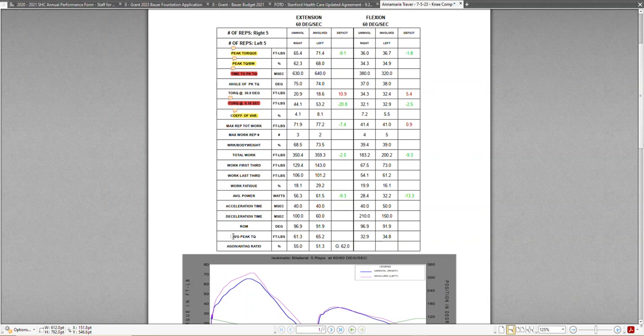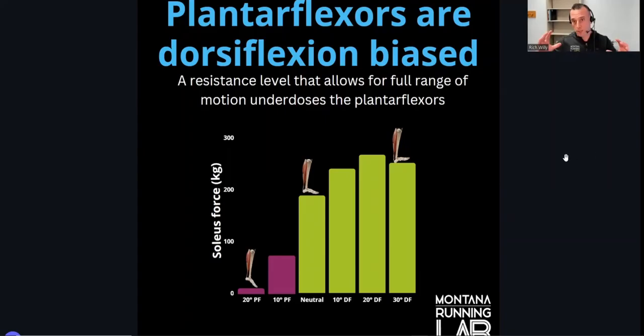And that's when you're setting up the test. For the knee, it doesn't have as much of an implication, but for instance, if you're doing someone's shoulder or their ankle, this matters greatly. Take the ankle for instance: someone's peak torque is well into their dorsiflexion range of motion. So if someone has limited dorsiflexion, then they may have an artificially tapered plantar flexion peak torque because they're not achieving that degree of dorsiflexion.